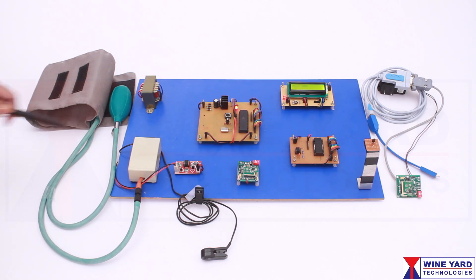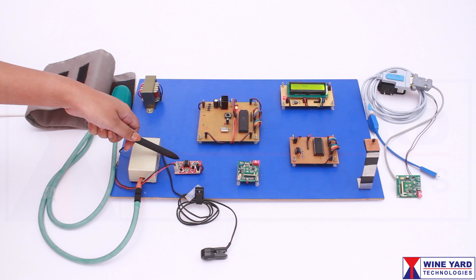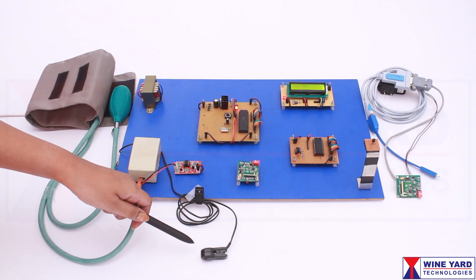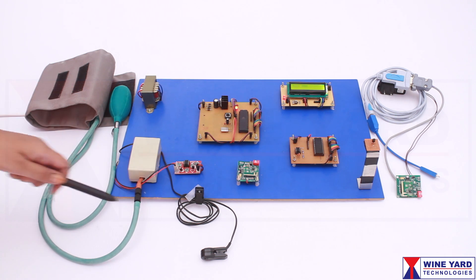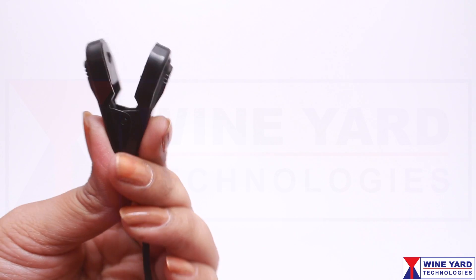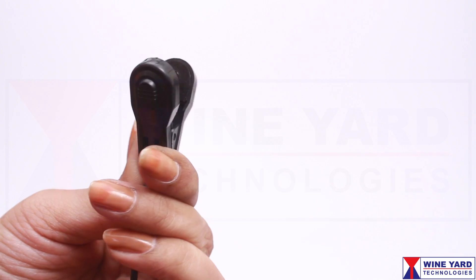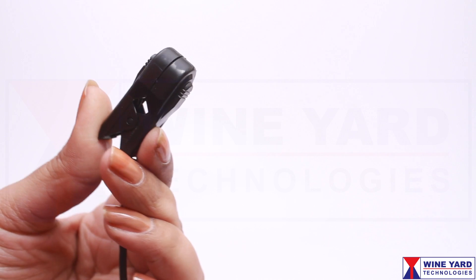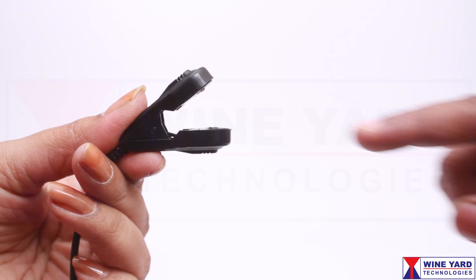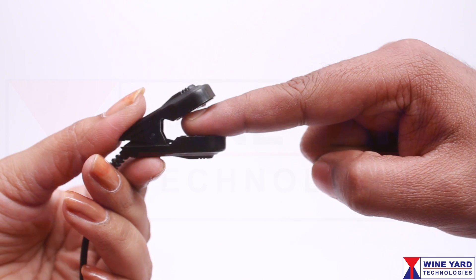This is the heartbeat module. This is connected with a pulse oximeter probe. An IR transmitter and receiver are fixed in this clipping mechanism. You need to place your finger in this clipping arrangement.